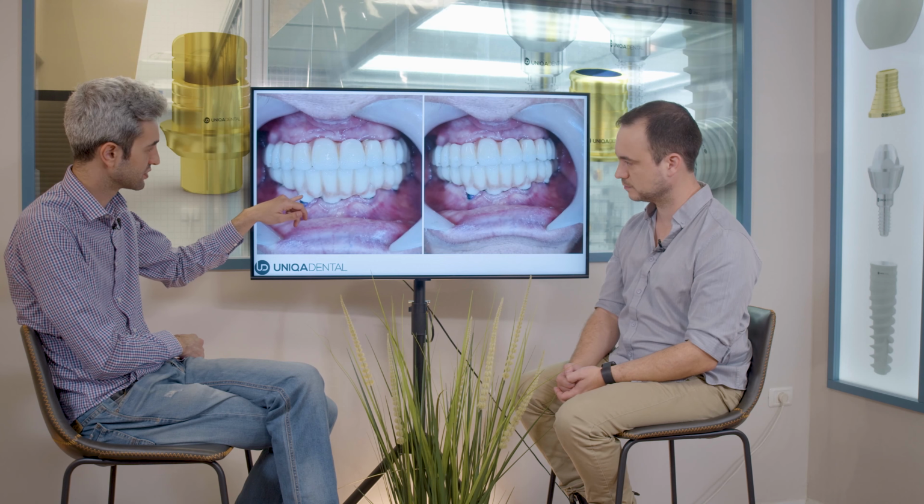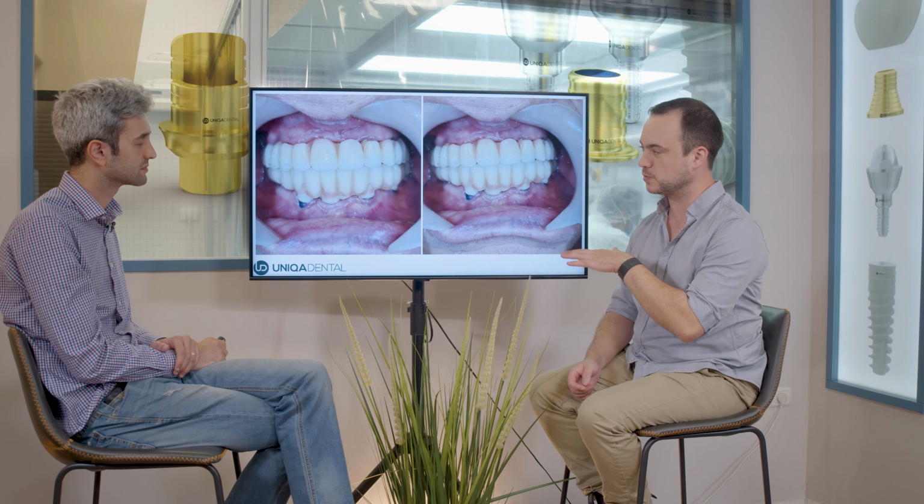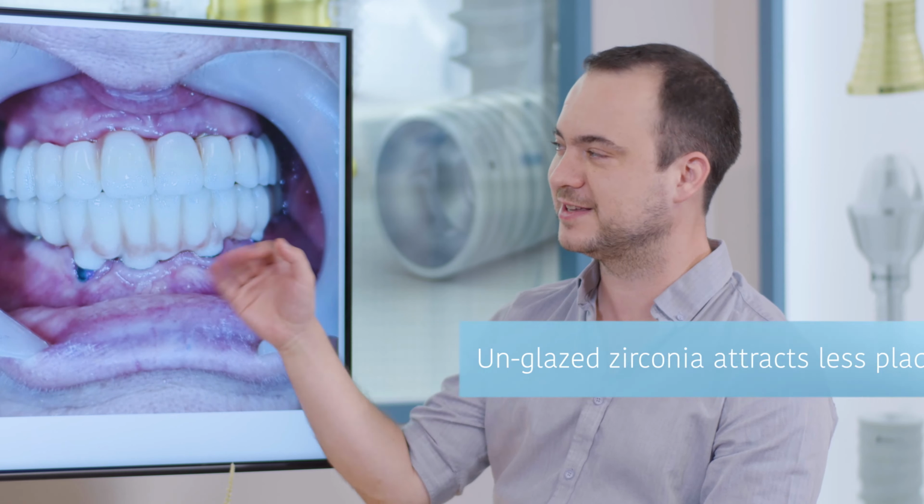I see here you chose not to color it pink, just to polish it. So when you're making full zirconia bridges, for the parts that are close to the gingiva, it's better not to glaze, because this way you minimize the retention of plaque. You mean the bottom, right? Yeah, the part that is close to the gingiva, because for the upper bridge it's the top part.